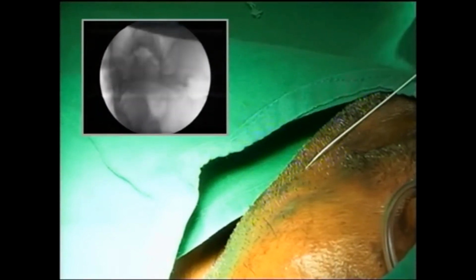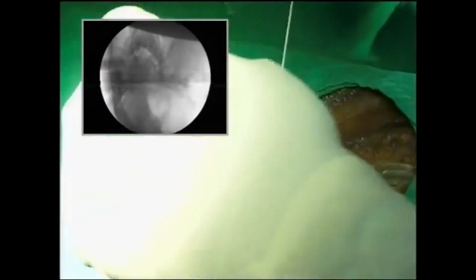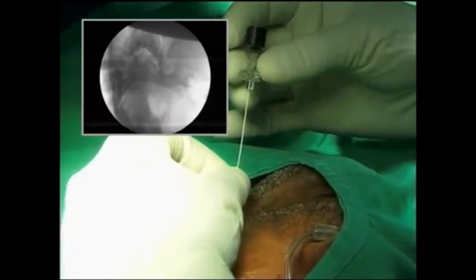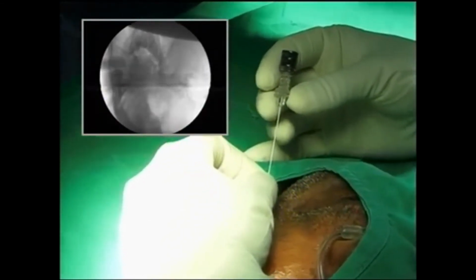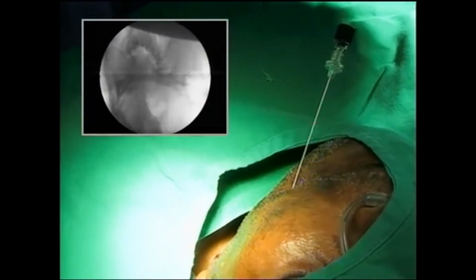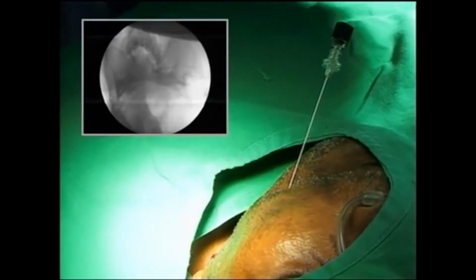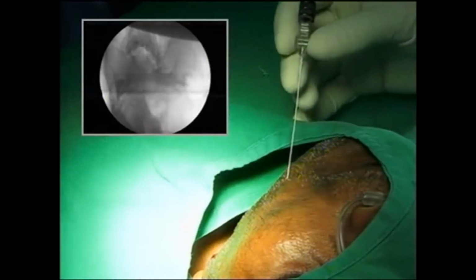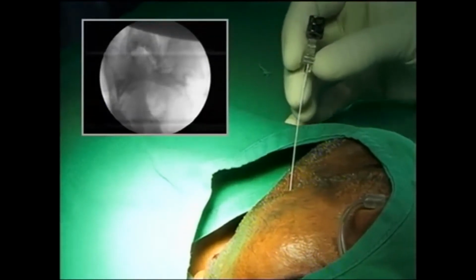Okay, so my needle is right in the middle of the foramen ovale there. So I've infiltrated local. I'm trying to go end on into the foramen ovale with a 22 gauge 10 centimeter RF needle with a 5 millimeter tip. Shoot. So you can see that my hub is on the left side, tip is on the right side, and the tip is actually hitting the ramus of the mandible. So I have to move it medially.